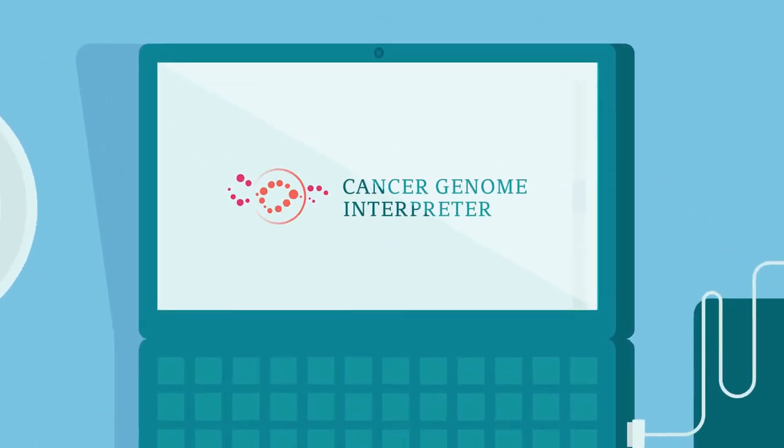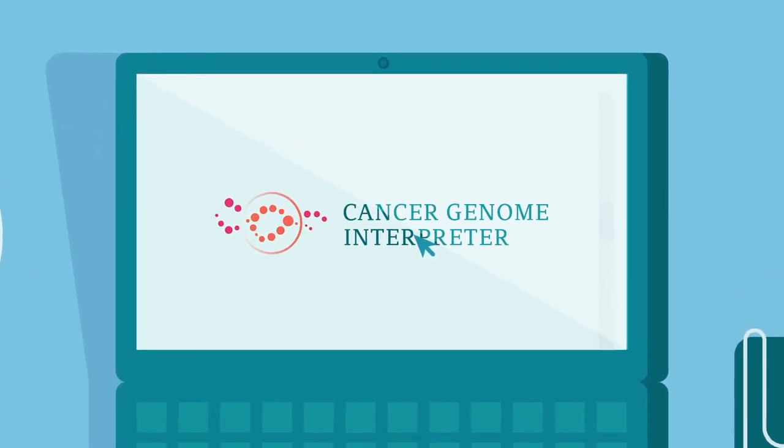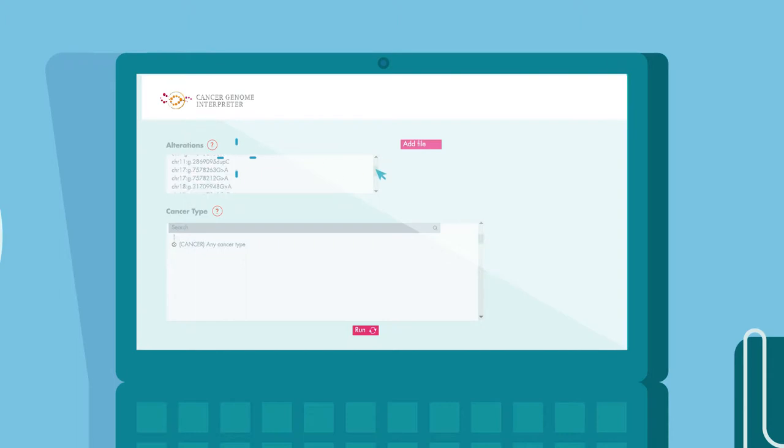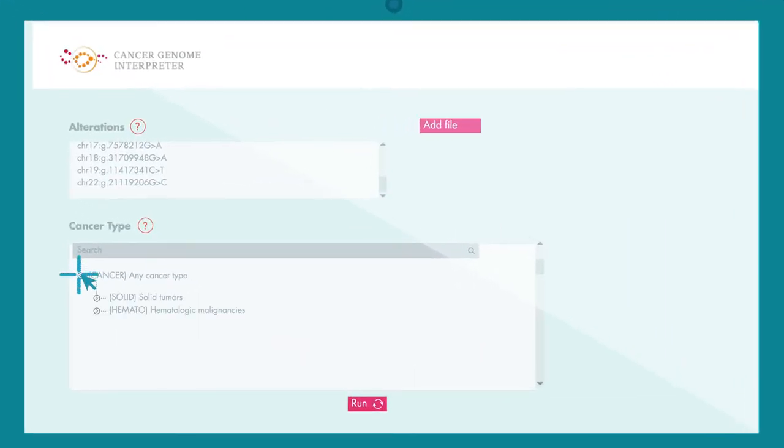The Cancer Genome Interpreter, or CGI, is an online portal where clinicians and oncology researchers provide the genomic alterations of a tumour sample and the type of cancer that they are analysing.